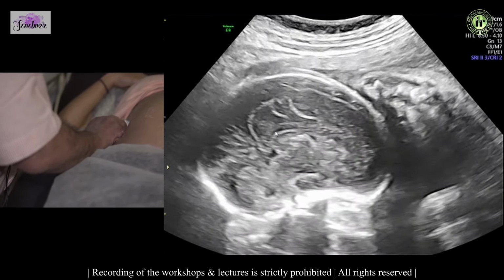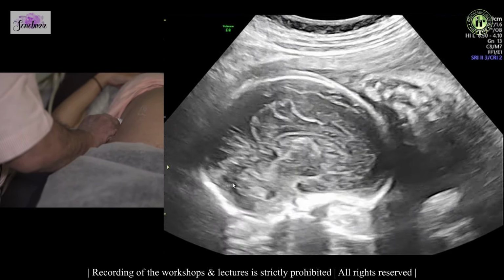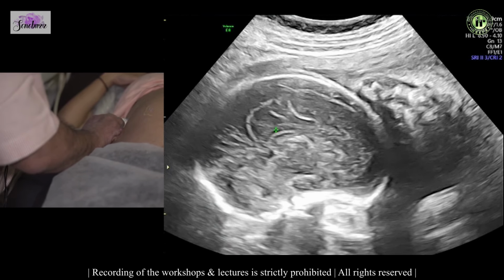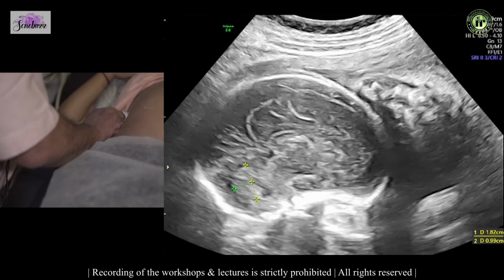And that is the vermis. Actually, we are scanning from the anterior aspect, so the vermis is not very well seen, but roughly you can see that that's the vermis. We measure the length of the vermis and the AP diameter.